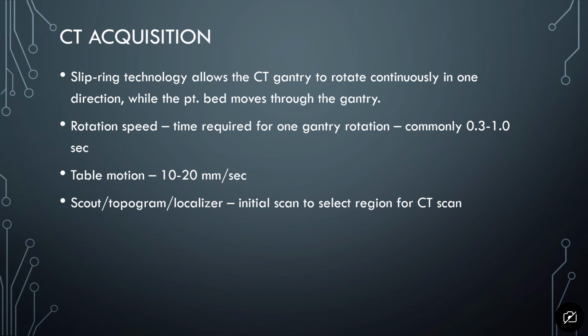The rotation speed is the time that's required for one gantry rotation. So this is the time that it takes for the X-ray tube to rotate all the way around the patient one time.